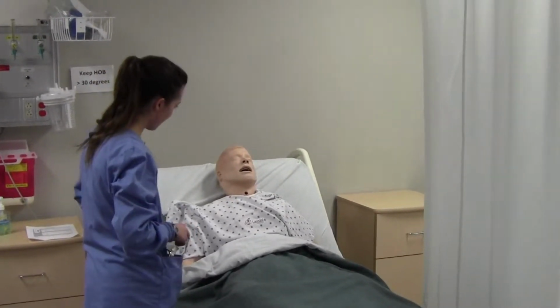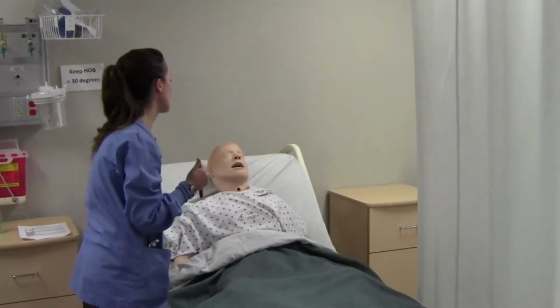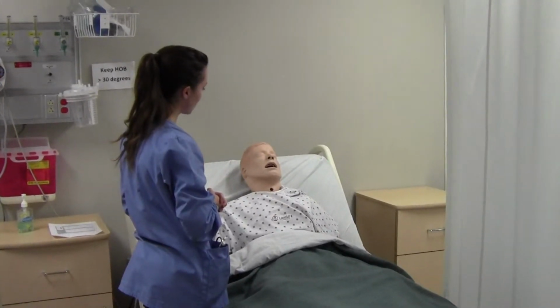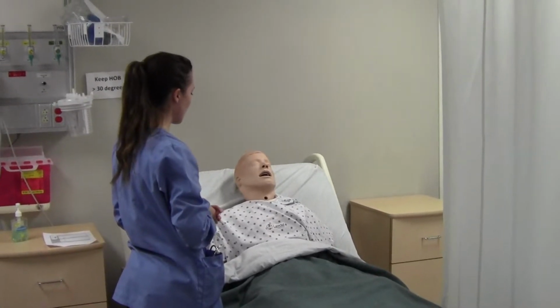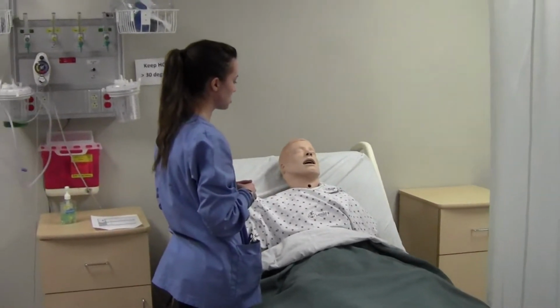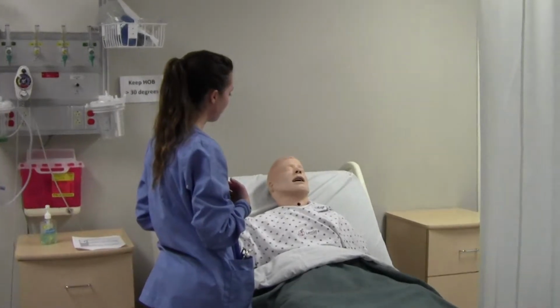Now I'm going to just look at your nasal passageway. You don't have any deviated septum. Everything looks okay. I'm going to ask you a couple questions about your nose that will affect the procedure. Have you had any history of nosebleeds at all? Okay, what about seasonal allergies? None with that? No nosebleeds with those? Okay. Have you ever had any esophageal varices? You don't think so? Well, have you had any liver problems at all, or any history of liver issues? No? Okay. And have you had any skull trauma or any head fractures?